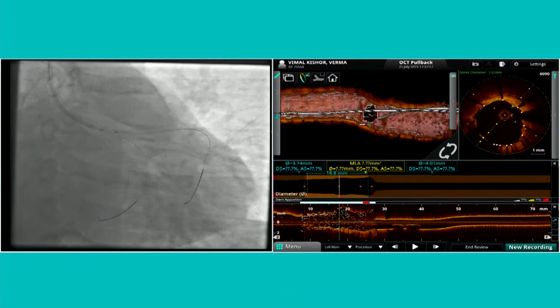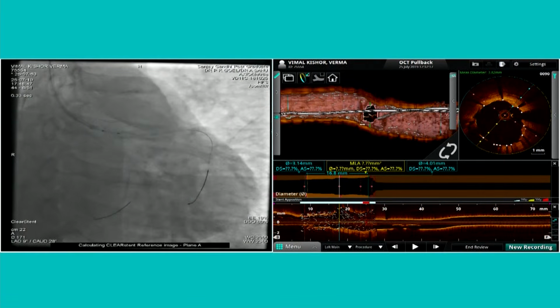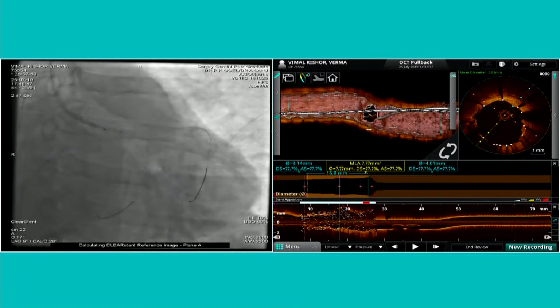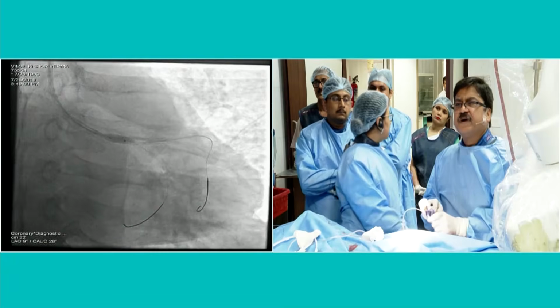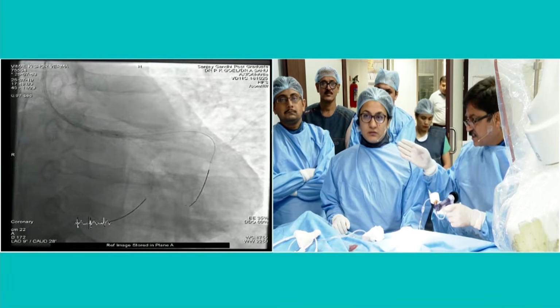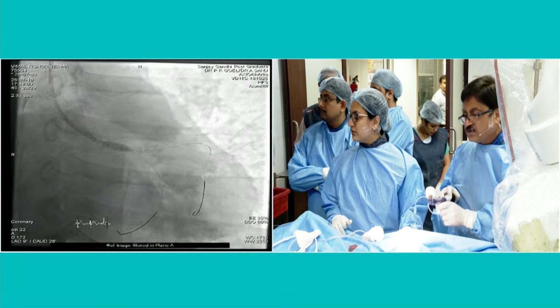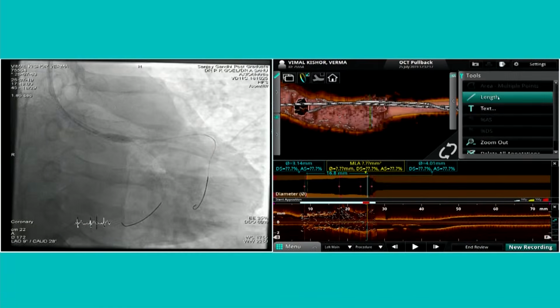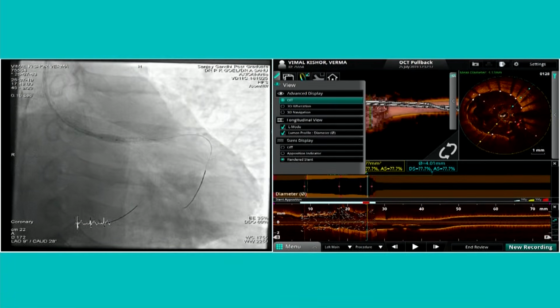It's okay. And I have to say, you are taking a 5 mm balloon. What are you doing, sir? You are taking a 5 mm balloon for post-dilating. This is 4.5 only. You did 4.5 already, no? Only at high pressure. Yeah, because that was the proximal-most end, and the pressure I used was only about 16. So I am trying to go a little higher on pressure this time, about 20. And I am slightly on the outer side, so maybe that will make a little difference.